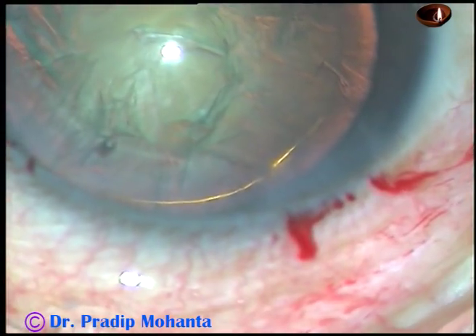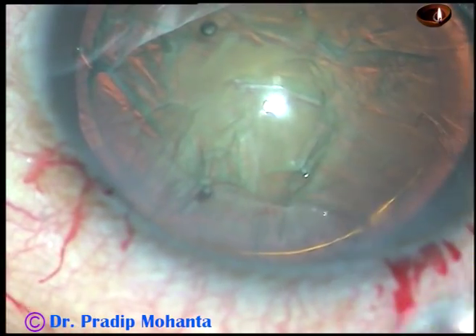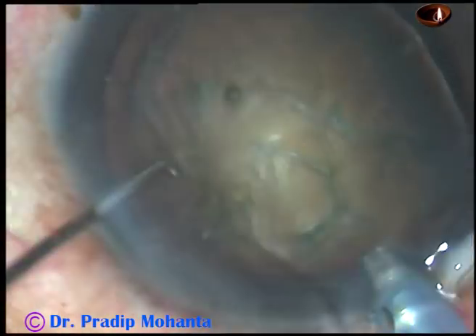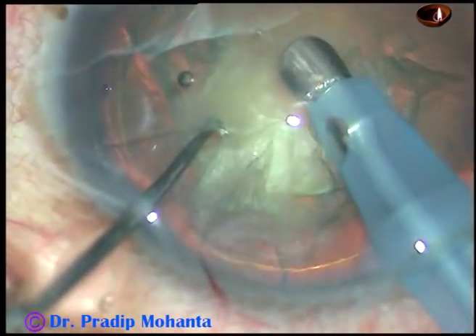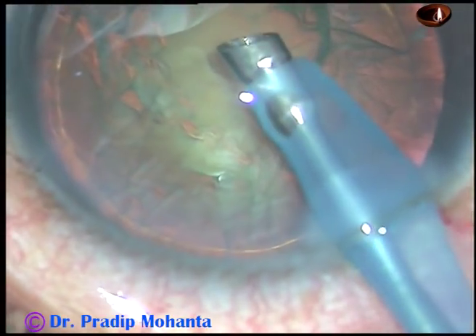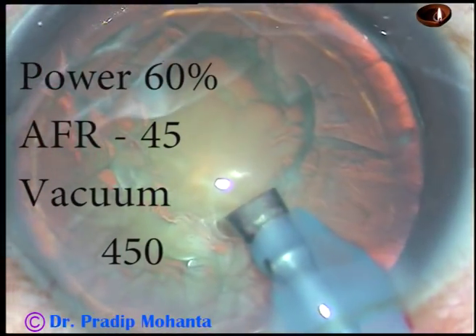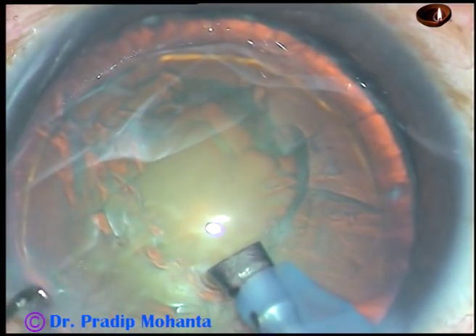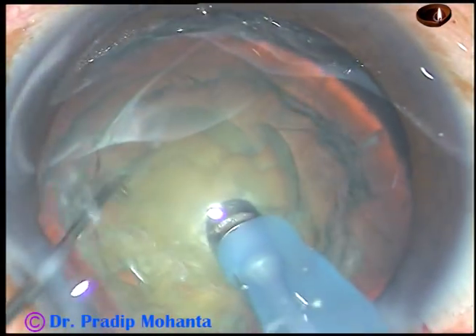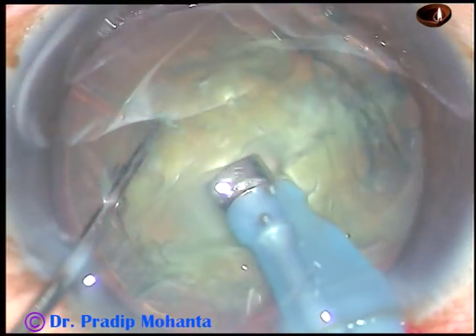Visco is again injected and now the tip of the phaco handpiece is introduced, bevel down — that is, the bevel towards the nuclear mass. Some superficial cortical lens matter is aspirated. The handpiece is then turned to make the bevel up. Now see, this is direct chop — the nucleus is held firmly and it is chopped.